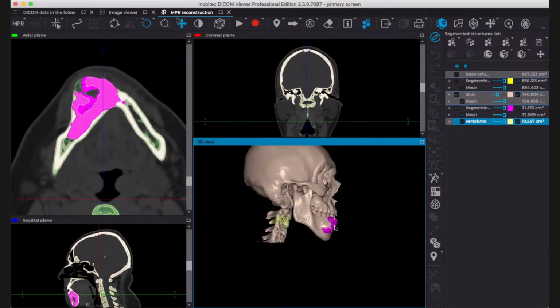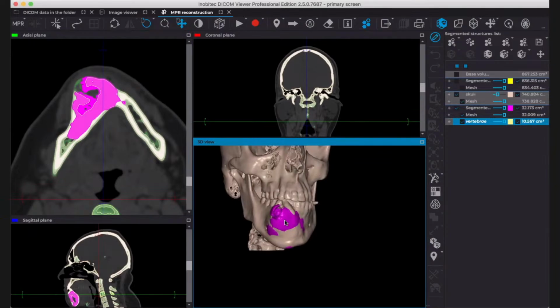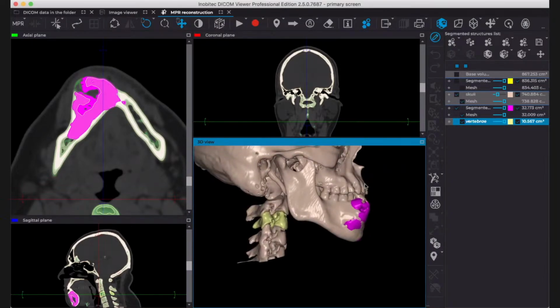Also, every time I go over something and I say, oh, this could use some adjustment, or I would like this to be in this other way, you can just tell them, and it's very nice that the software is updated and they include everything that is useful and could make the software better. So I think that's a very nice thing, having all these people behind the software. The software is alive and it's changing with you and with your needs.